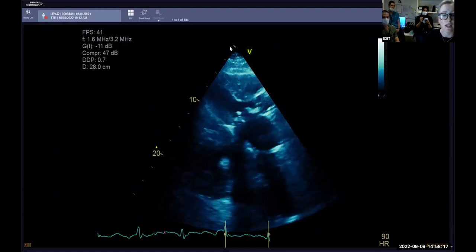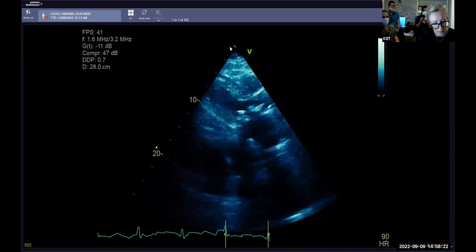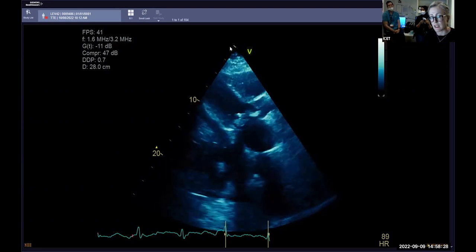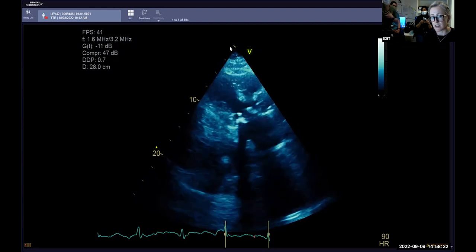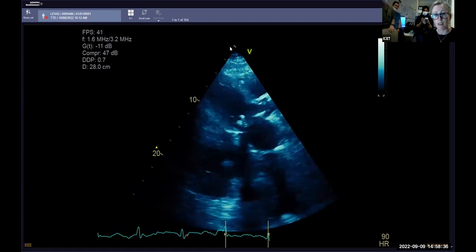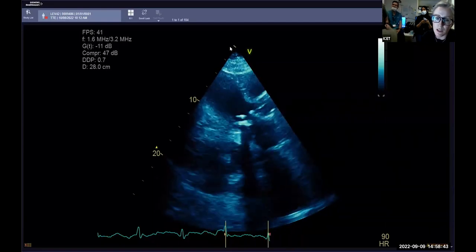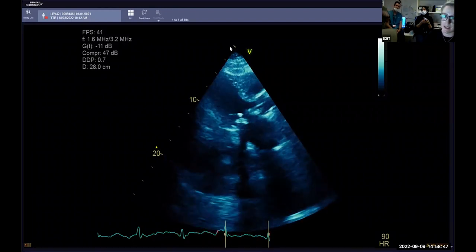So this is another patient that we had. The story was of bioprosthetic valve query function. It's a patient that was on the ward. They weren't particularly unwell, and it was an echo to assess the prosthetic. They were admitted under respiratory. Yeah, I think this was a patient being treated for a pneumonia. They're on CPAP for non-invasive ventilation.